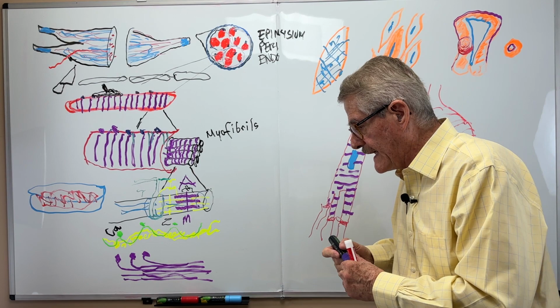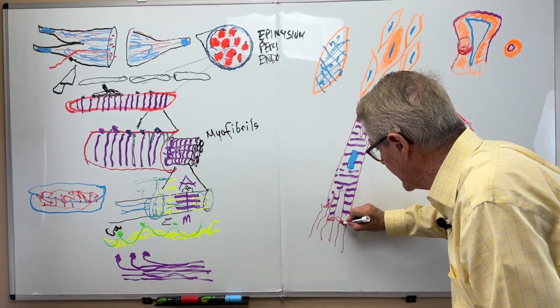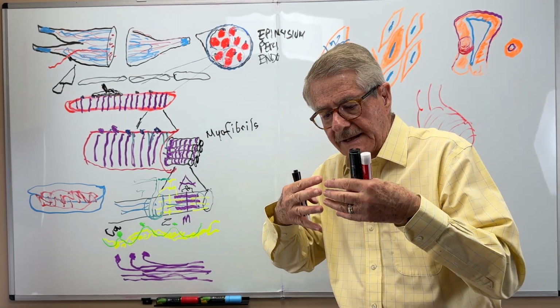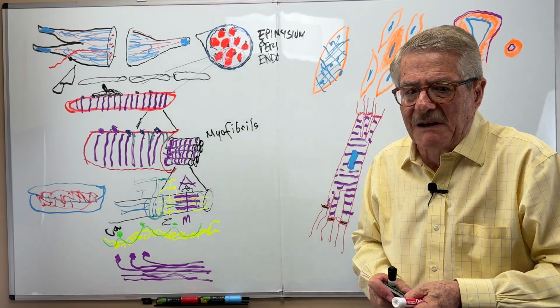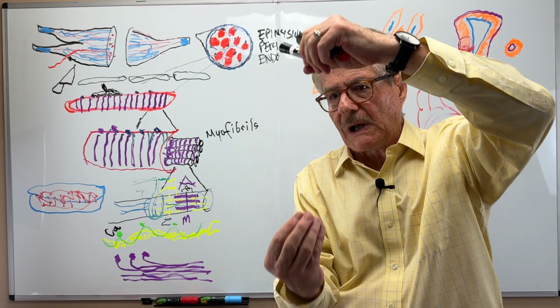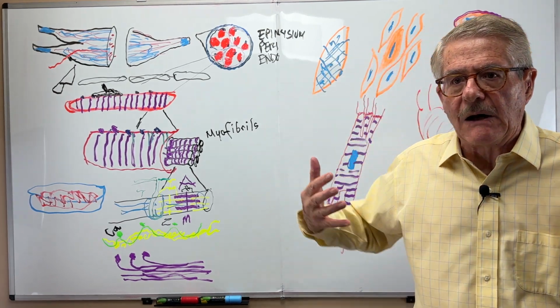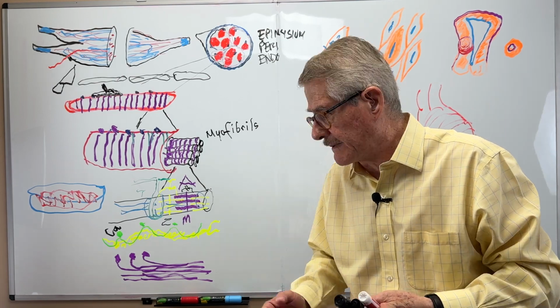Now, we call these structures intercalated discs, essentially darker areas that are points of union between two cells, like finger with finger, and are composed of fascia adherens. It's almost like a zonula adherens, but longer. Also, we have desmosomes, and also gap junctions that allow the conduction to proceed in a fast fashion.